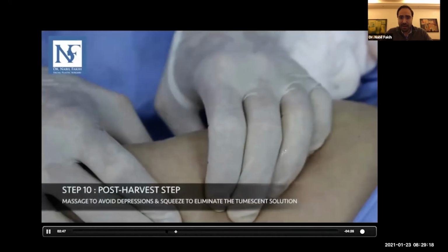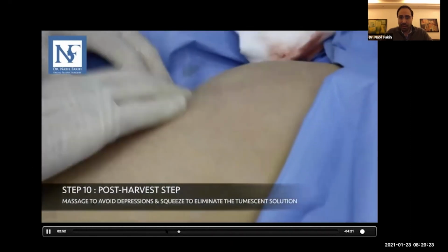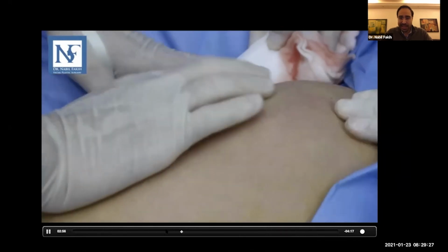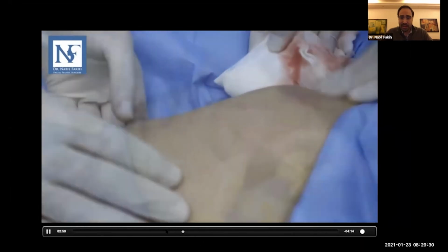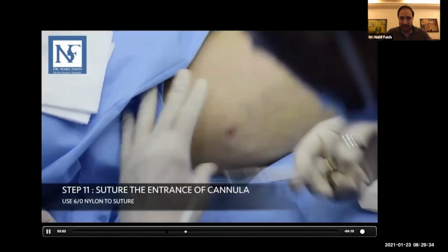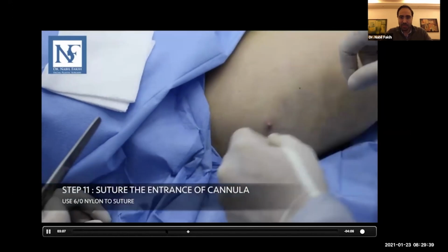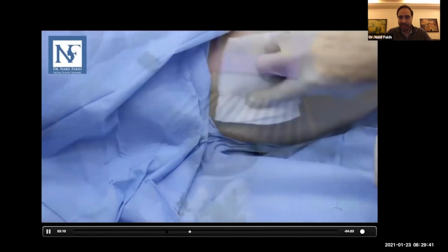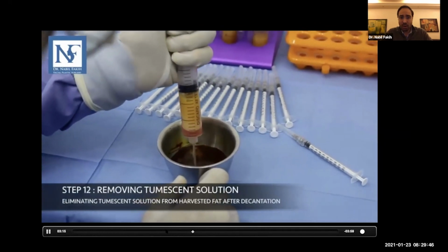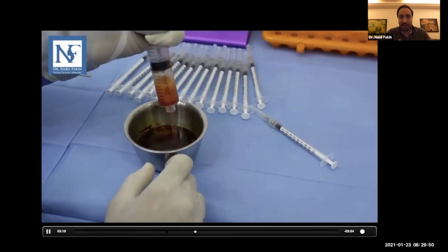So let me jump. After this, I harvest, and I take out all the tumescent solution, because by this I can create less bruises. I inject also tranexamic acid inside to reduce hematoma. Normally patients don't want to see hematomas, and they don't want to get bluish effects, so we inject some tranexamic acid. I clean all the microfat. This is microfat harvesting. Okay, till now we have only microfat.